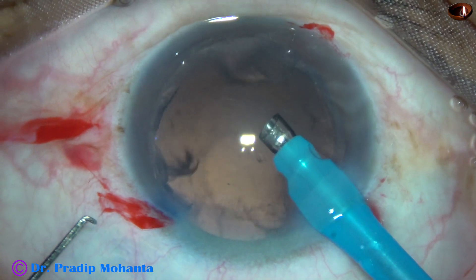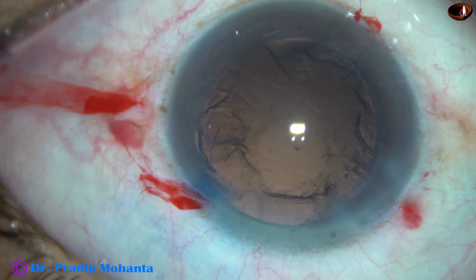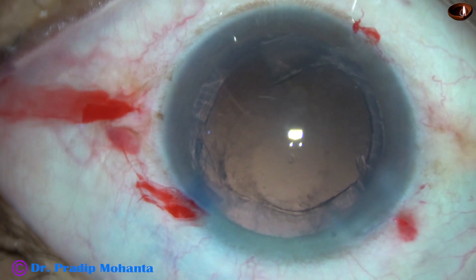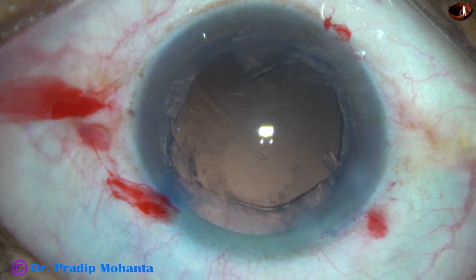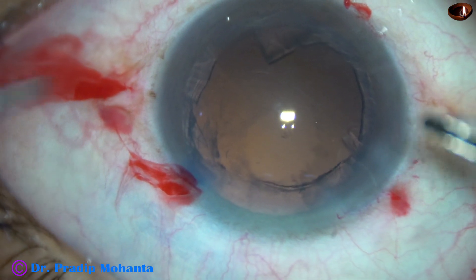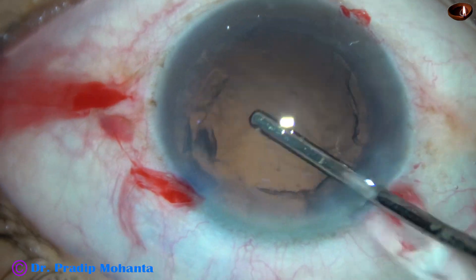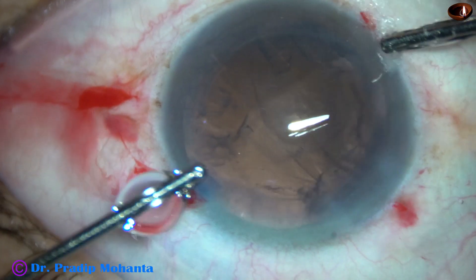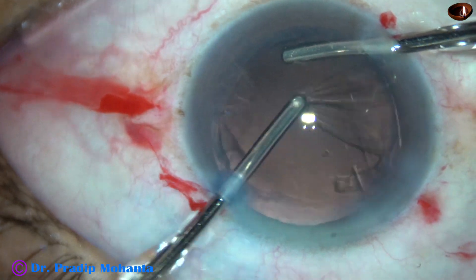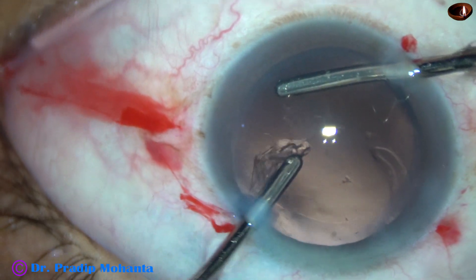This is the epinucleus. The epinucleus has also been removed, and now we have to remove the cortex. I am going to use bimanual irrigation-aspiration to remove the cortex. The irrigating probe first goes in through the main wound and hydrates all the cortex all around, so that when you pull the cortex, it comes easily.